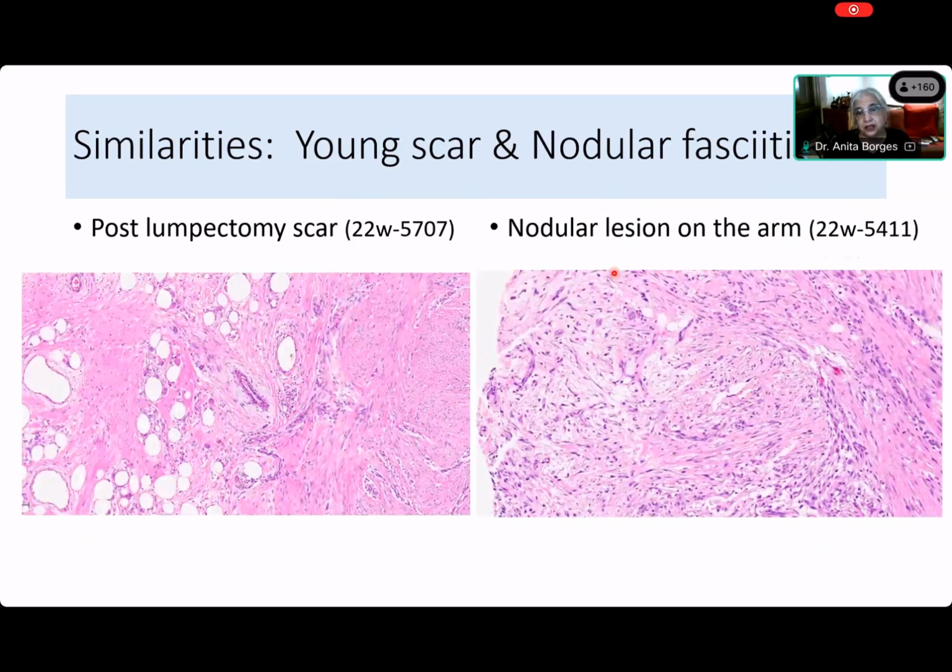Now what I want you to understand is simply this. Okay, this is a post-lumpectomy scar in the breast, and this is the nodular lesion. This is another nodular lesion on the arm, and I want you to look at the similarities between the two. There is good similarity between a young scar and nodular fasciitis. Okay, so when you are looking at scars, when you know that they are scars, like after a lumpectomy, don't just brush that off and say, oh, there's no tumor seen at the lumpectomy site. Look at the scar, and very often a lumpectomy is done within 3 weeks of a biopsy.